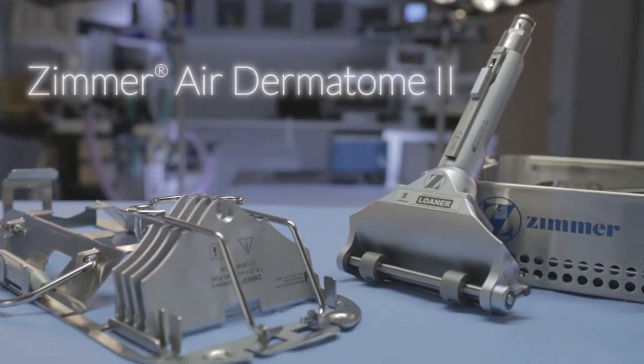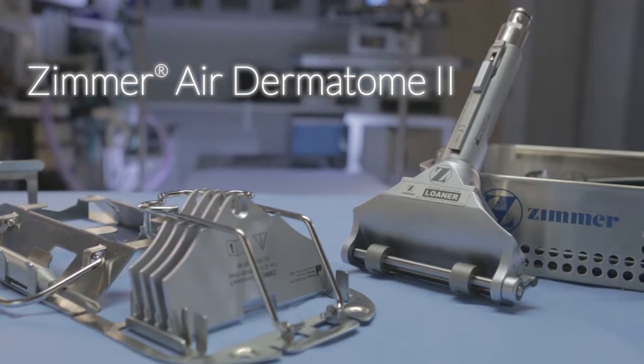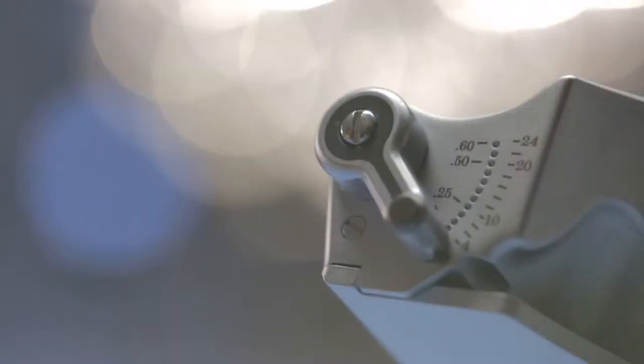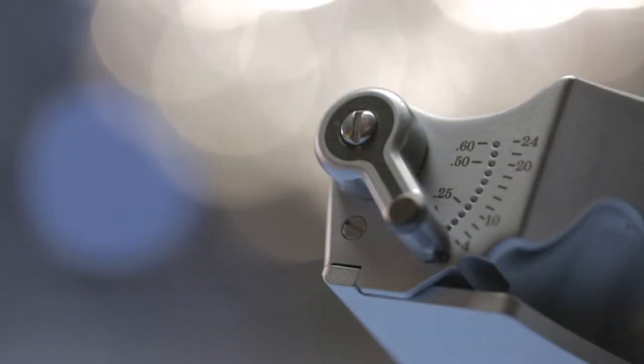Hello and welcome to a video tutorial on the Zimmer Air Dermatome II. This new product is an air-powered instrument designed to provide variable graft thickness. It has capabilities from 4 thousandths to 24 thousandths of an inch.